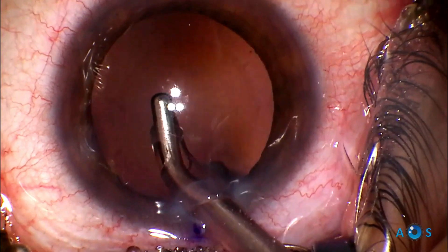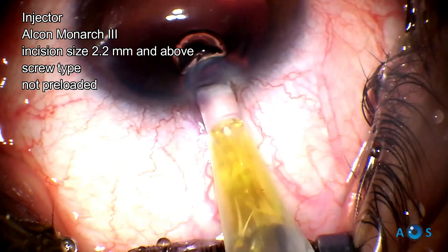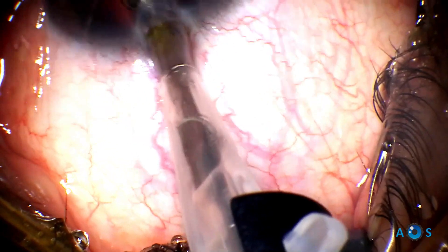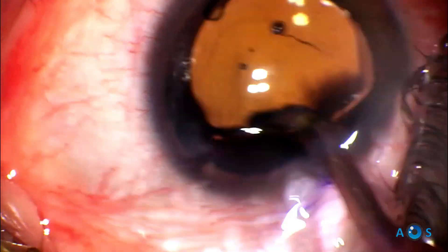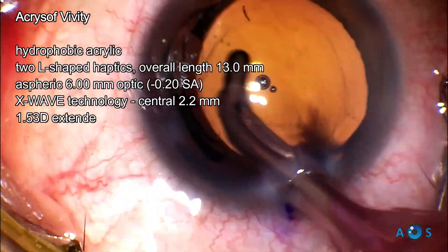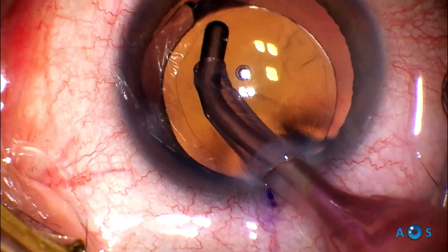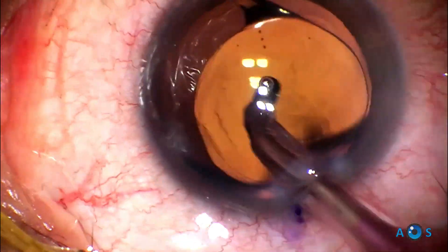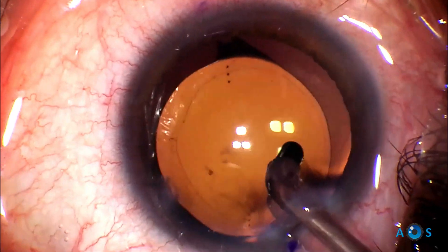Moving on to extended depth of focus lenses, this type of lens employs various optical properties to extend the field of vision. One of the most recent is the Alcon Vivity. This lens is implanted through the Alcon Monarch III injector. The Vivity lens does not use diffractive rings, but instead has a central convex area which acts as a refractive wavefront shaping element. This results in an extended focus corresponding to about 1.5 diopters, while minimizing loss of contrast and photic phenomena. Despite not using diffractive rings, in order to achieve the best vision results, the surgeon should aim for optimum centration of the inner convex element which provides the proprietary X-wave effect.